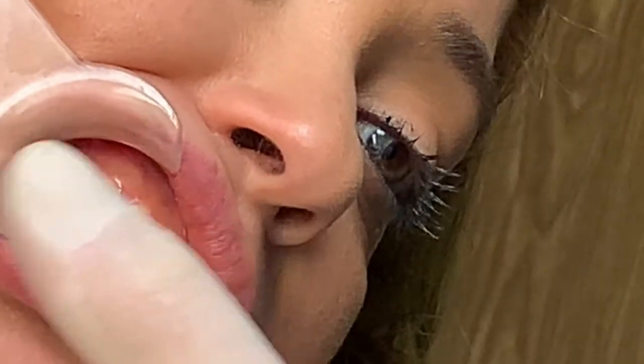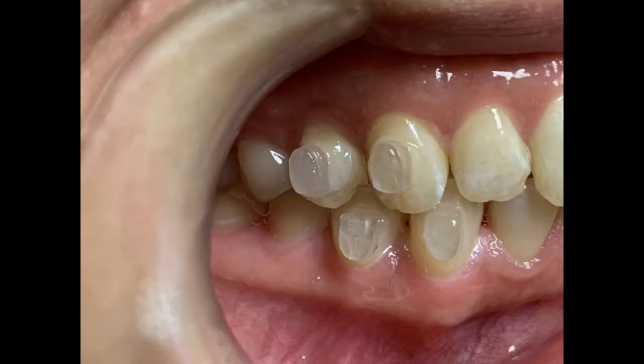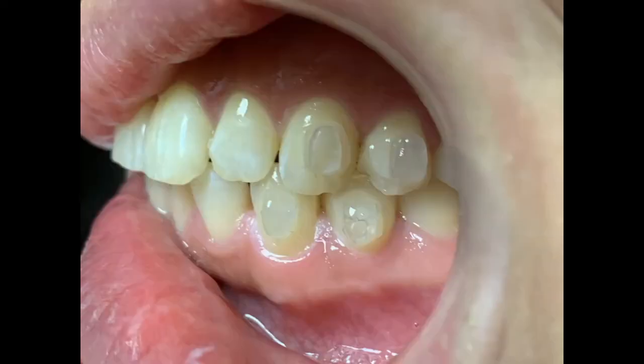Okay, that's pretty good. If Gloria were an actual patient, all eight brackets would now be bonded on the canines and first premolars. And I would teach her how to place the wiring using a dental model. For this video, let's look at the demonstration that I share with prospective OJW Ultralite patients.